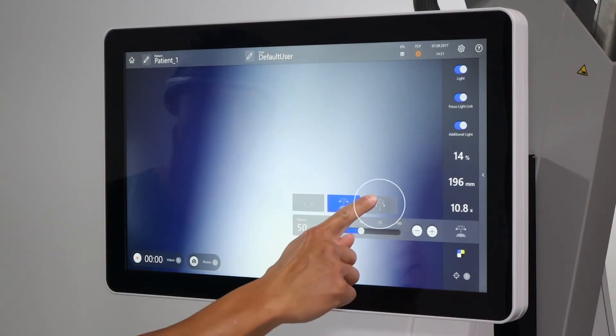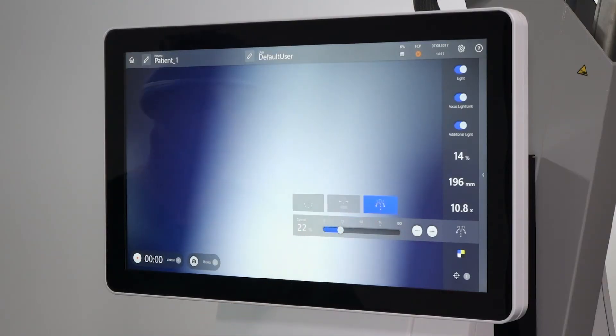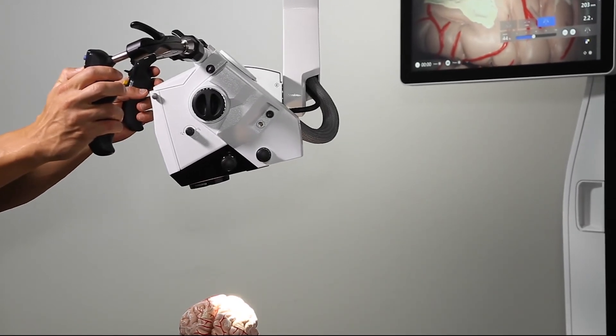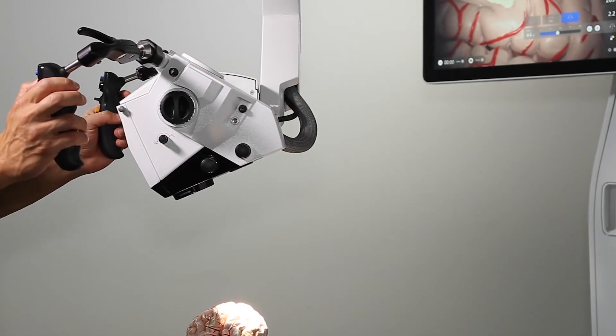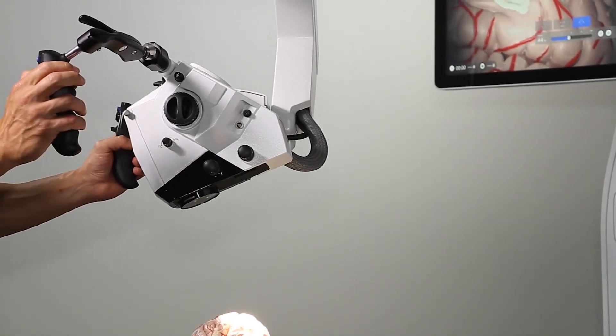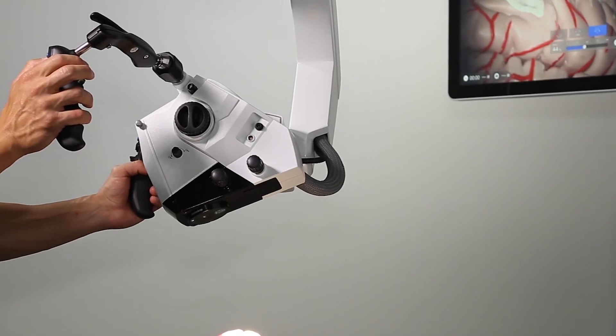The third mode is Motorized Point Lock movement. Motorized Point Lock enables movement along the focus point, changing the angle of observation without losing the anatomical focus. Motorized Point Lock restricts Z-axis movement.